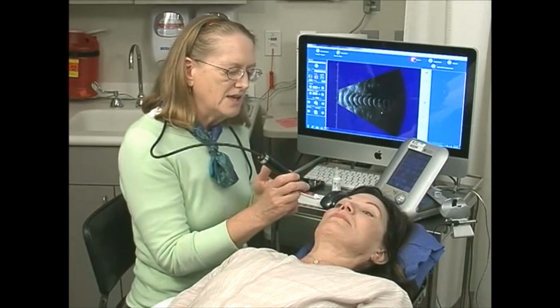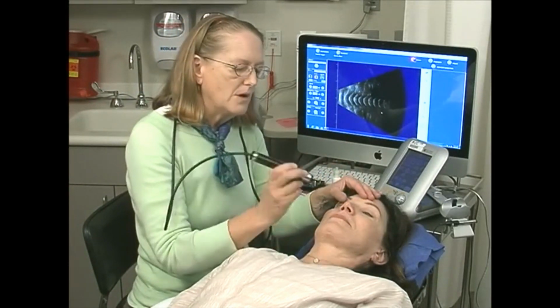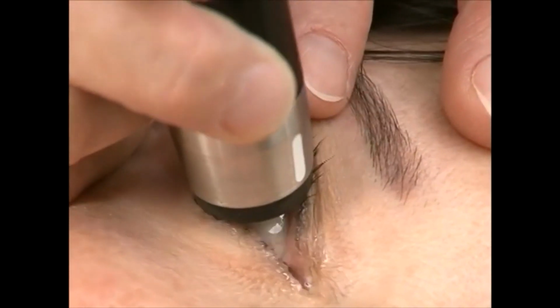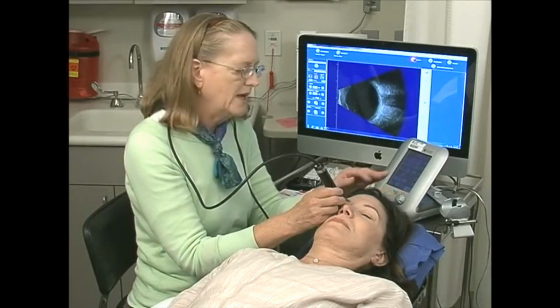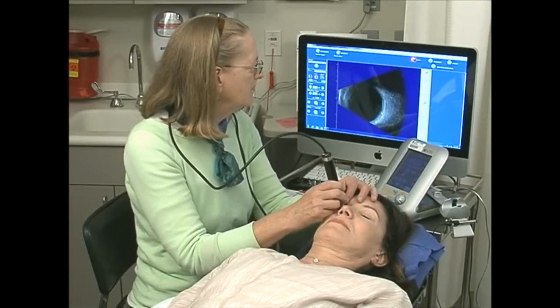Now the second exam for horizontal is of the inferior aspect. Marker again to the nose, patient looking down to their toes. Place the probe on the superior limbus, localize the optic nerve, see the optic nerve shadow? Occasionally you might need a little lower gain just in order to see that probe shadow more clearly.